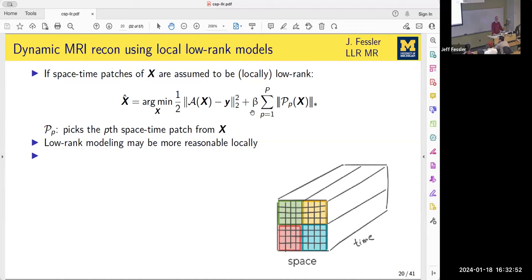So your model only considered Gaussian noise. Mm-hmm. The MRI is highly undersampled. It also has undersampling. When you talk about undersampling noise, you're talking about taking the adjoint of A and applying it to Y and reconstructing an image. That image absolutely would have aliasing artifacts and all sorts of complicated noise. But the noise in the raw data itself is Gaussian noise. There's no undersampling noise in the raw data. You're talking about taking an undersampled spiral and doing a zero-filled adjoint reconstruction of that. So it's absolutely an excellent approximation here.